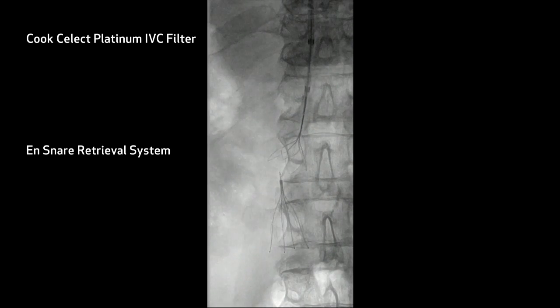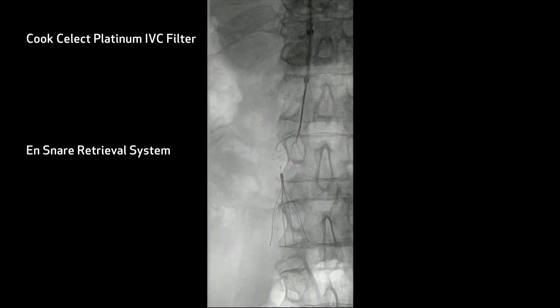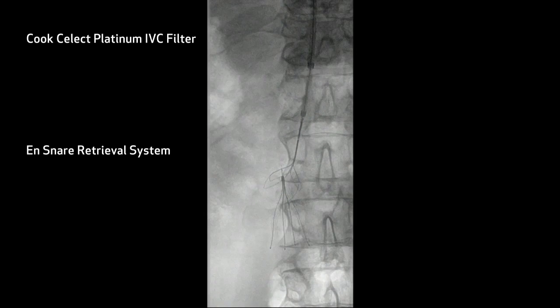First thing we do is show a cavagram, make sure there's no evidence of thrombus within the filter. We then use this dual sheath retrieval system with an end snare. You can see we've opened the end snare, spun the end snare — clearly not engaging this hook at all.